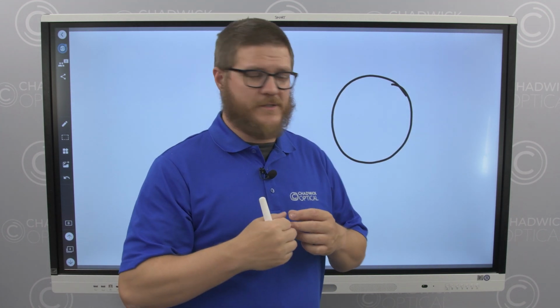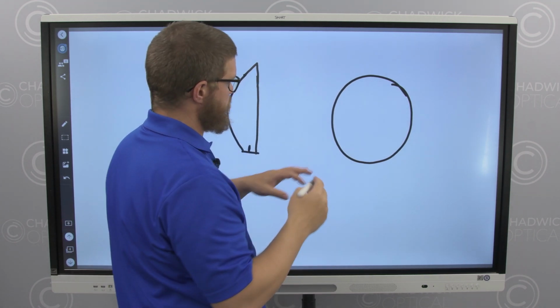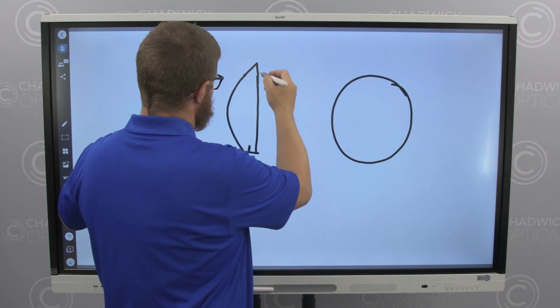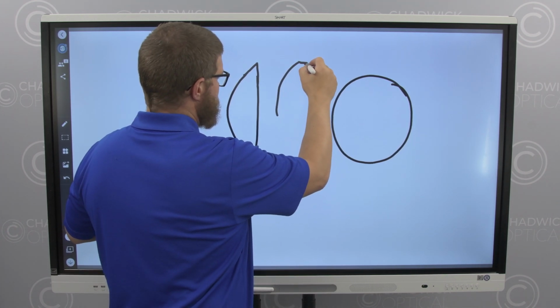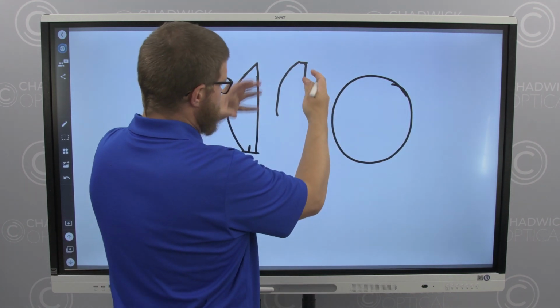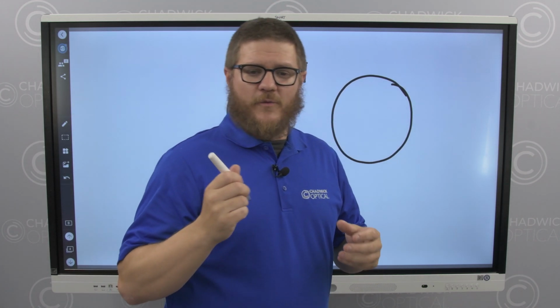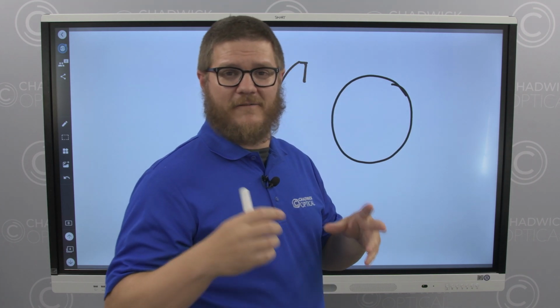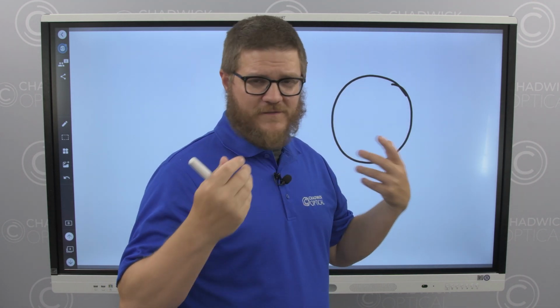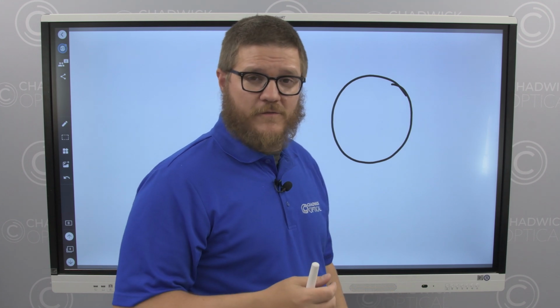The other scenario where we would need to make a lens thicker is on a drill mount lens. On a standard rim frame, we might be able to make what we call a knife edge, but with a drill mount, we would need to make the edge closer to 2 millimeters. So when we make that thicker edge, once again, that lens thickness needs to carry throughout the lens. While that frame might look really cool with plano lenses in it, if you have a prescription of a +4, a +5, a +6, or beyond, I would stay away from these particular frame styles.